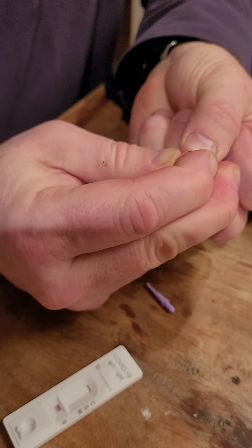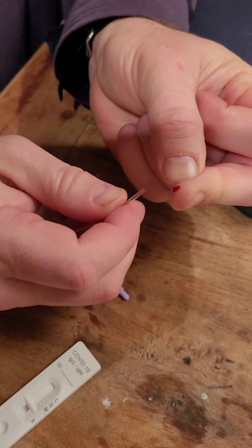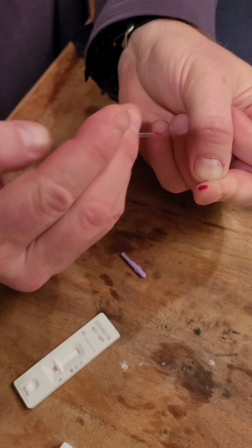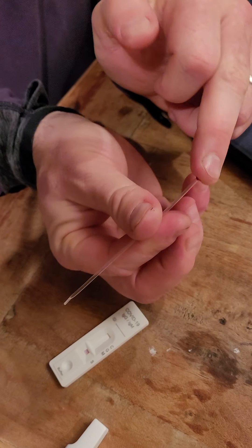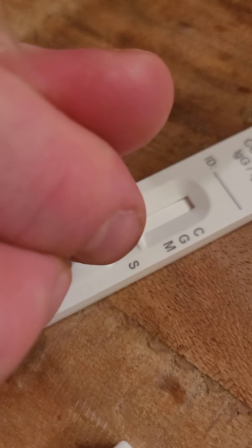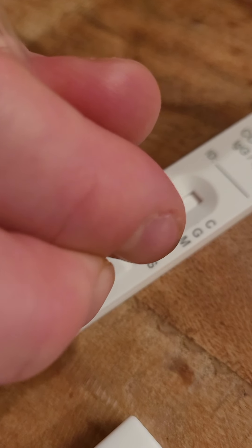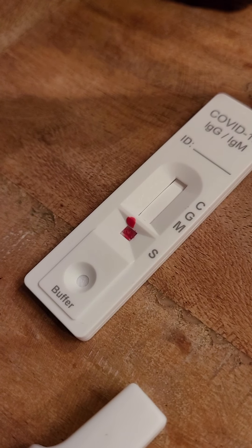You want to try and get a whole drop of blood like that. Fill that up, and then... I missed that one spot here, let me make sure I get a little bit more.